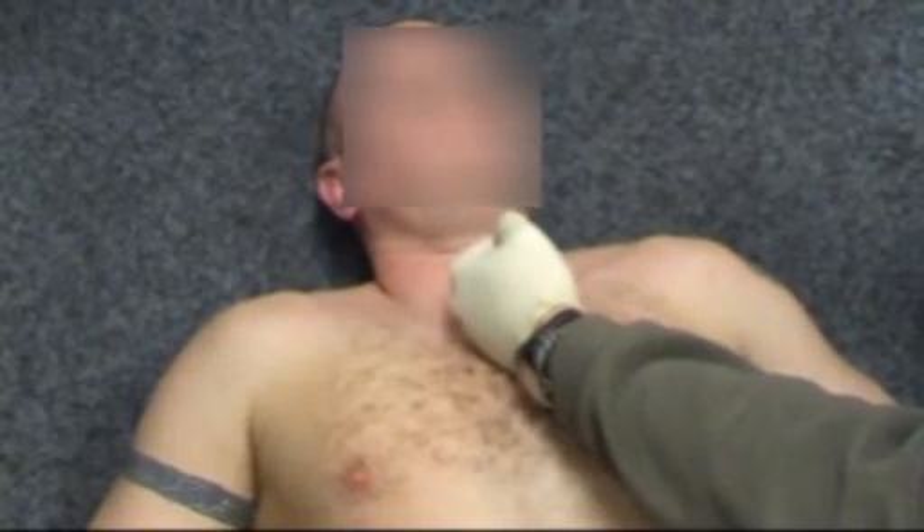Have you got it? You're all videoing it — you want to be watching it. Okay, so this is a proper pack.